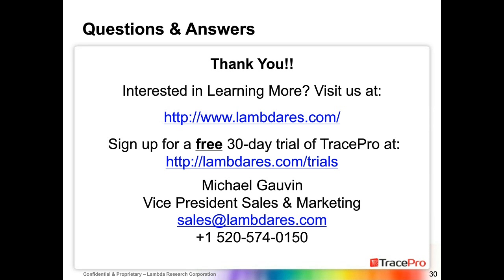You can specify it as a variable and how far you want that variable to move around, and then see the results and have the program use a nice little local optimizer, the downhill simplex method, to go through and then optimize based on that variable and the merit function that you program into the optimizer. What is the solver for the ray trace? We use Monte Carlo ray tracing. Okay.